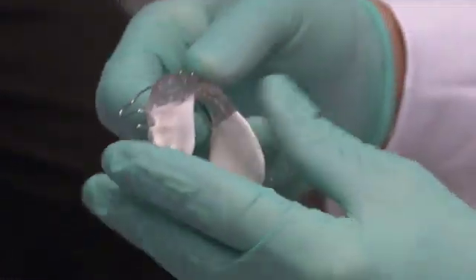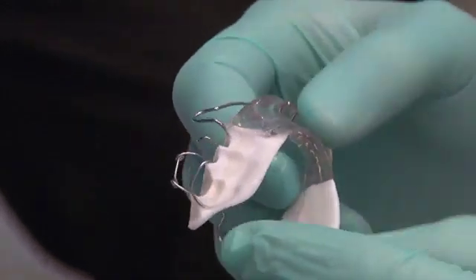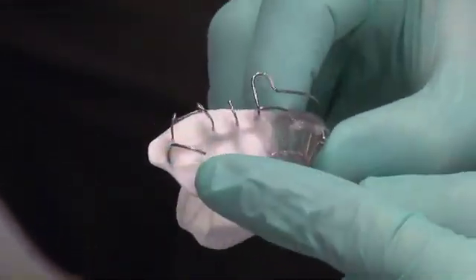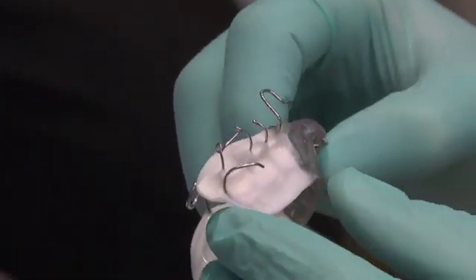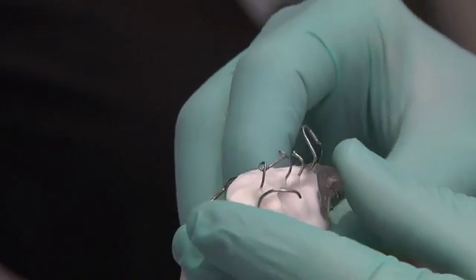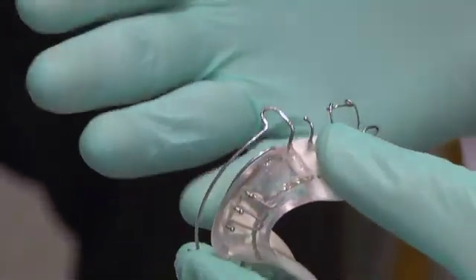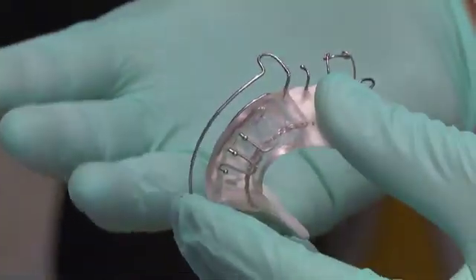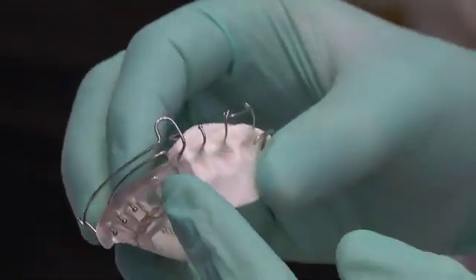Turning the appliance to the mandibular side, you can see it's plain and simple: there's the ball clasp for retention and the terminal C-clasp. The terminal C-clasp really helps this appliance stay in at night. Some free-floating bionators have major problems with patients — the appliance falling out at night. This design basically locks the mandible in the position I want as I control eruption of the teeth.